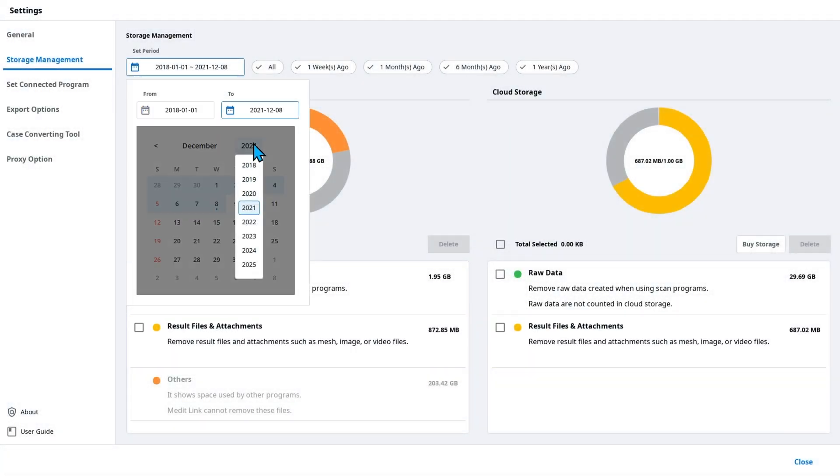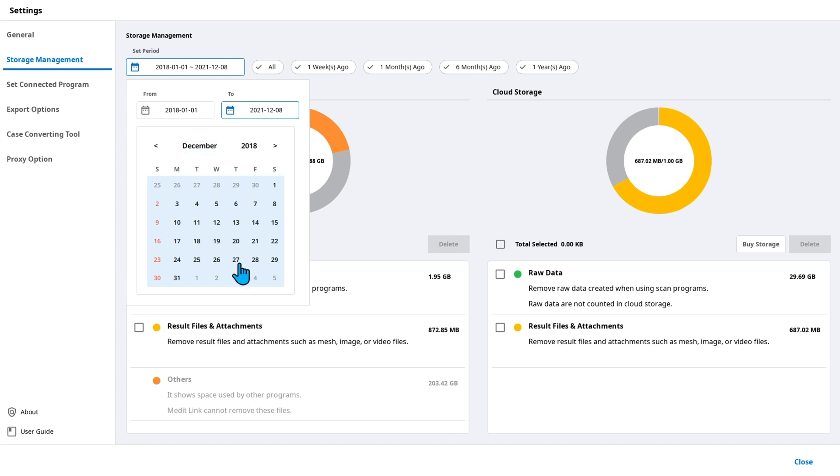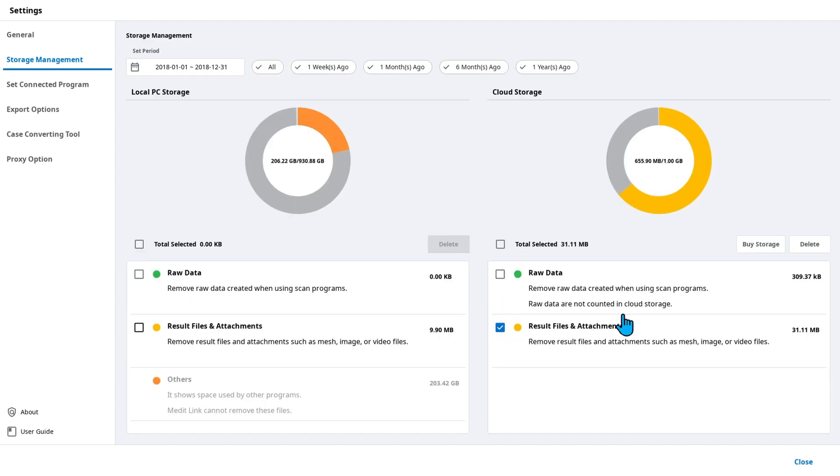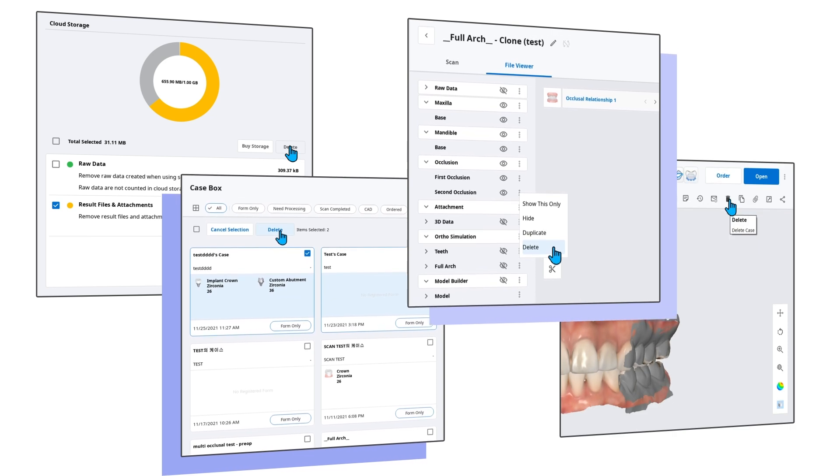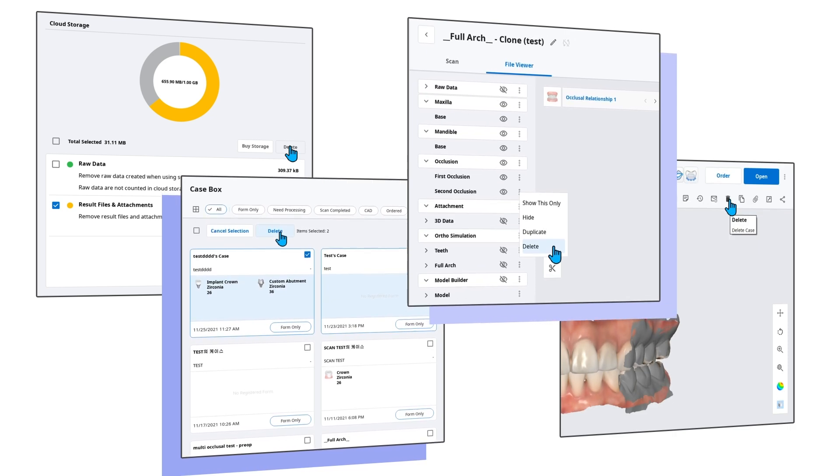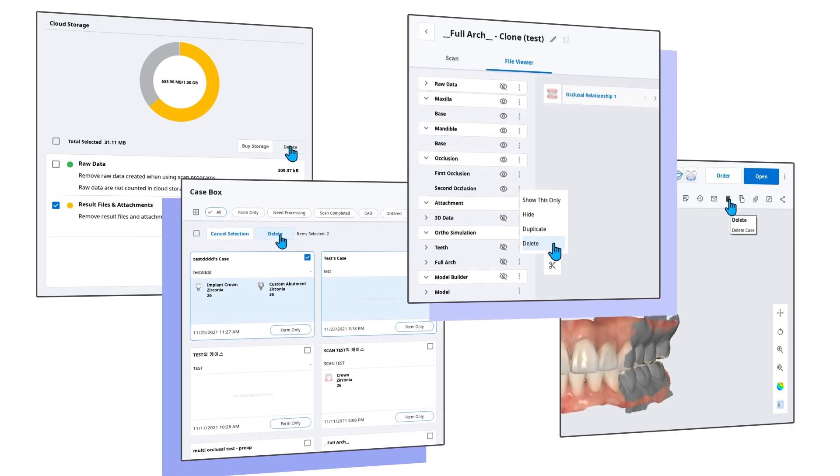On the top, you can set specific search period and then delete files created during that time. Use any of the above methods to free up your storage space.